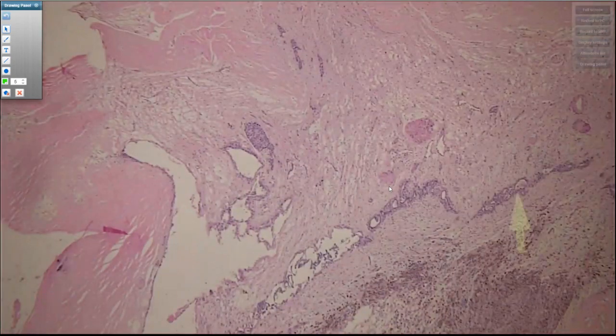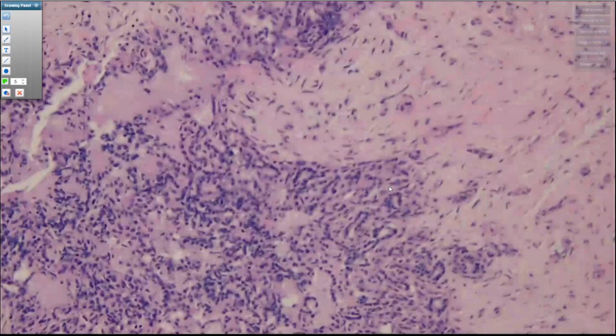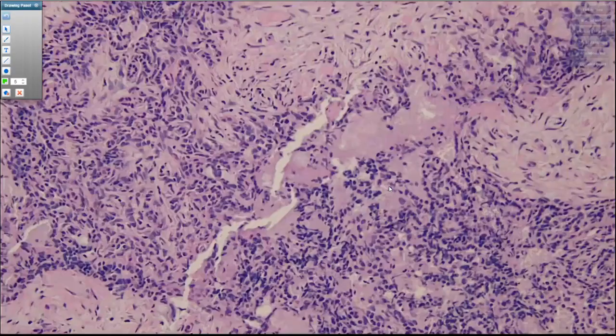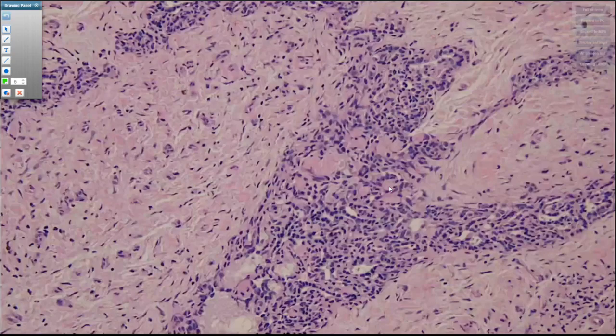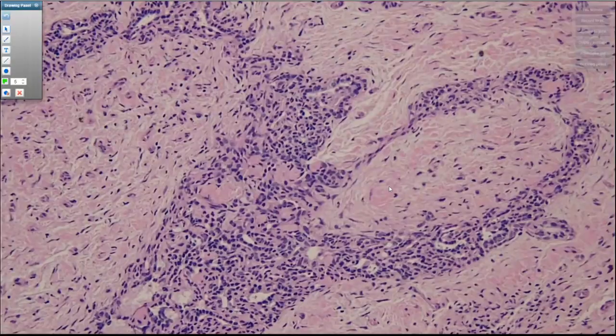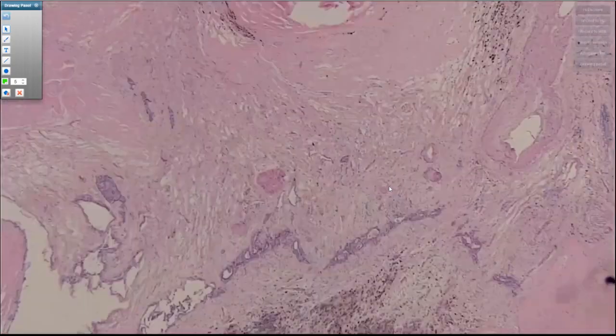And in some areas, it's gotten so compressed and reactive, it's a little bit difficult to tell exactly what you're dealing with. They look small, but they're not as nice and round as we're used to seeing in those cysts that haven't undergone degeneration. They're a little bit darker. They've got some reactive change in them now, so some of them are a little bit angulated even. They don't quite have that nice round appearance that they did. And usually if you hunt around enough, you can find an area that looks a little more classic.